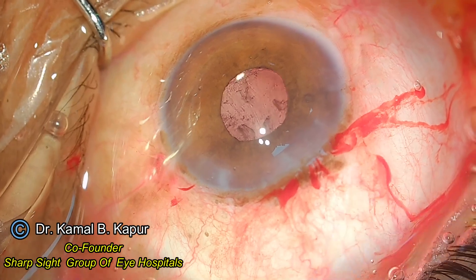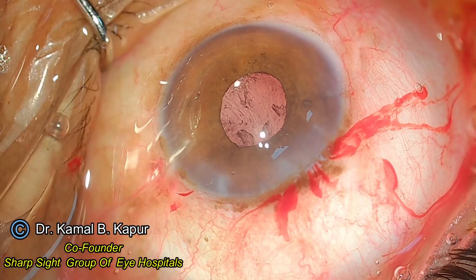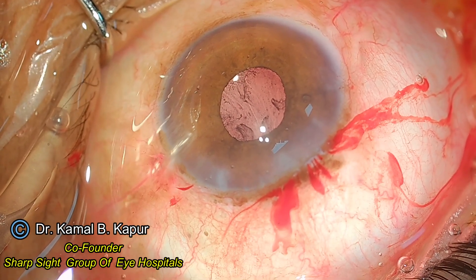I will instill a small amount of viscoelastic before proceeding to suture the wound. Since it is 3.5 millimeters I do not want to take chances — I will just suture it.